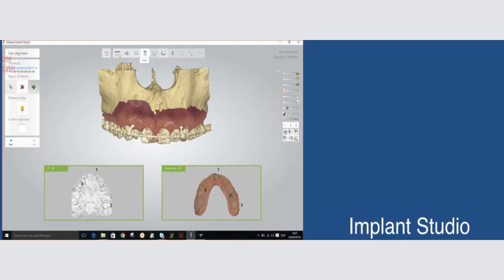Here is one thing that I would like to tell you. At least here in Brazil, it happens to me, and I've been pushing some ortho people to not ask for a CBCT with braces unless it's strictly necessary. Why? Because you can have scatter when you do a CBCT, and that can make your alignment difficult. One example is this case, because the patient, as you saw in the first scan, had the CBCT with the ortho braces on, as you can all appreciate here. So this makes things a little difficult. But anyways, I was able to line them up.